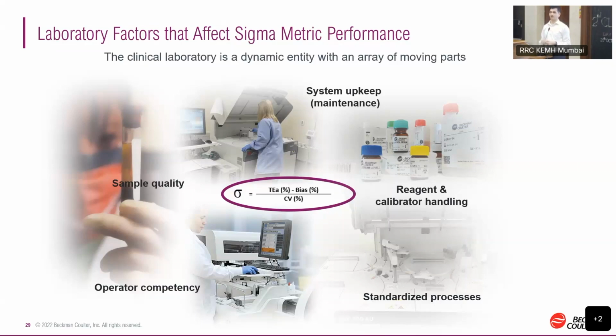Suppose today a maintenance takes an hour, and I have been doing it for many years. I may find some shortcuts. I may not be consistent over the years in performing the same maintenance. So consider the maintenance steps and time.